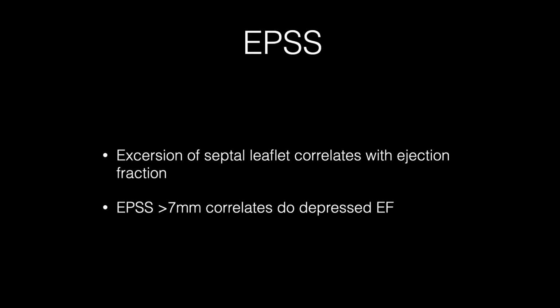And to be perfectly honest, there is a formula you can plug the number into and get a reasonably accurate calculation of the ejection fraction, but that formula is just something I can't easily remember, and I don't know if it's really important to remember because we can Google it whenever we want. But it definitely gives us a way of quantifying that ejection fraction.